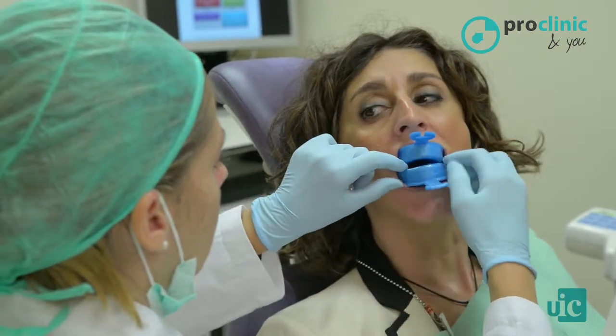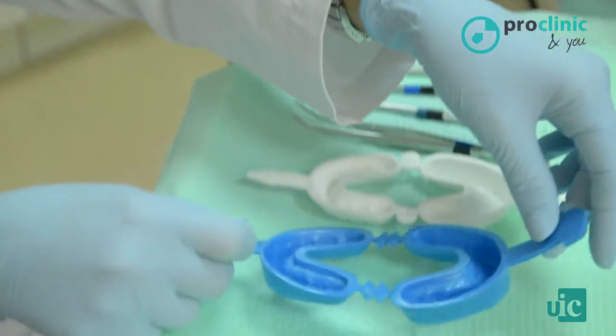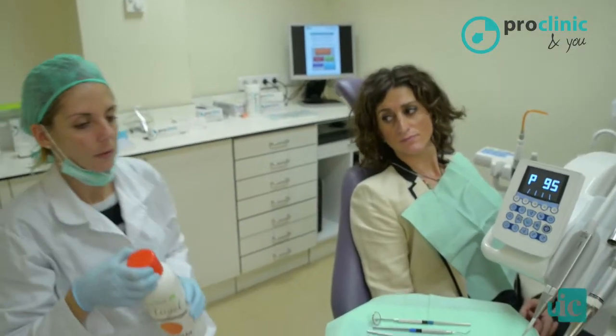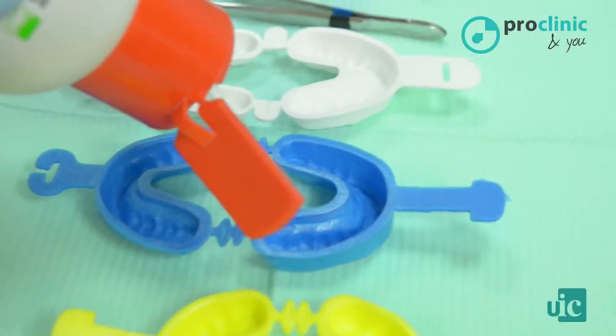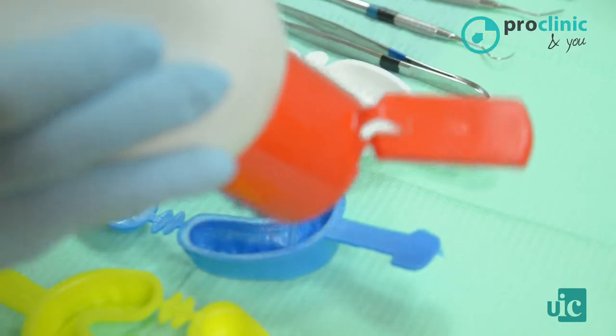It is important not to swallow and to have the tray with fluoride enough time inside the mouth. The first thing we should do is to try the tray to see which is the best size for the patient. Once we have seen which one is the right size, we should put the necessary amount of fluoride in it. We have to place a row of fluoride in both the upper jaw and at the bottom of the tray.